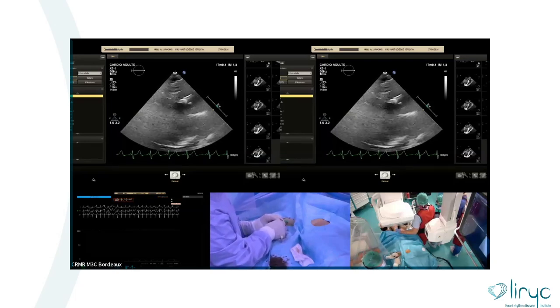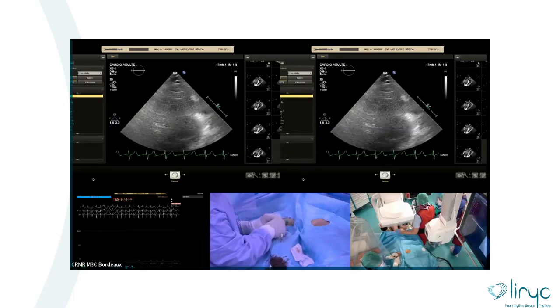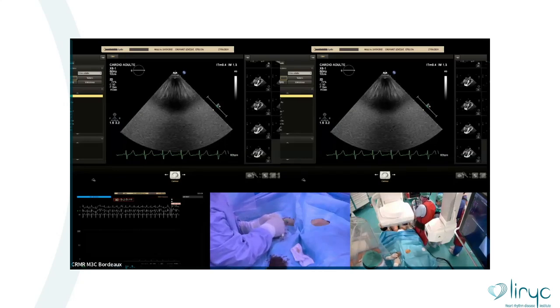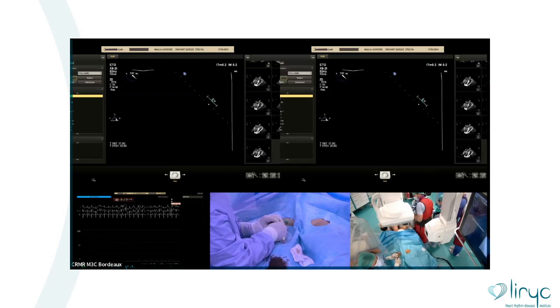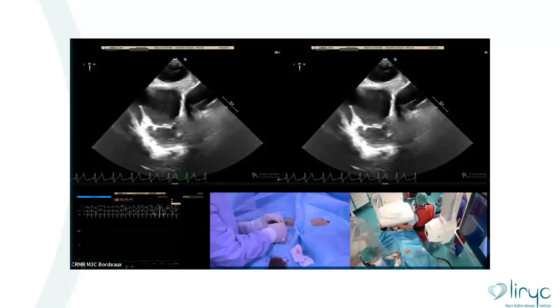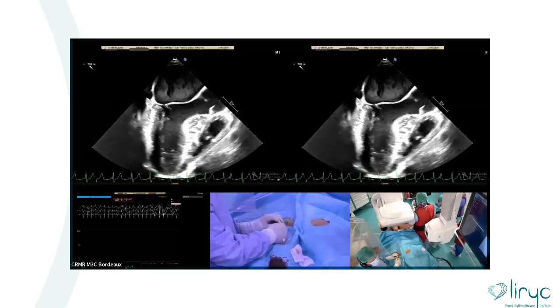Maybe on T. Olivier, what do you prefer? Yeah, go ahead, I prefer it anyway. Yeah, T is better. All right, for intracardiac structure. Long axis, to show the valve and the aorta.